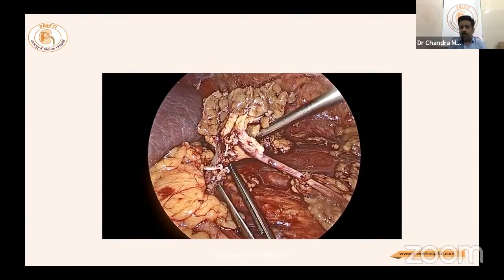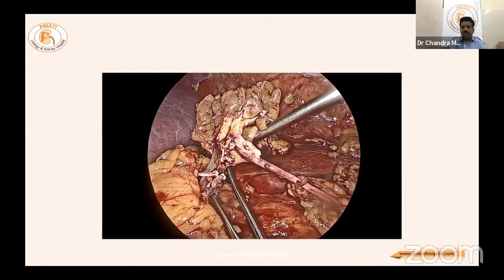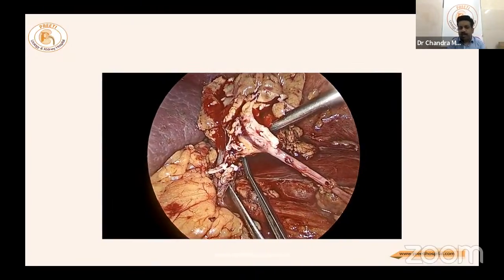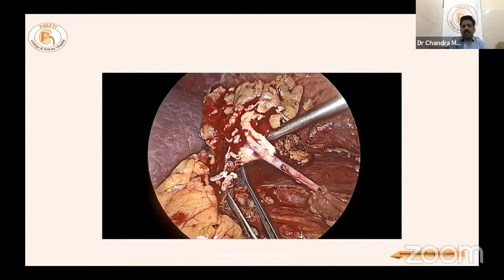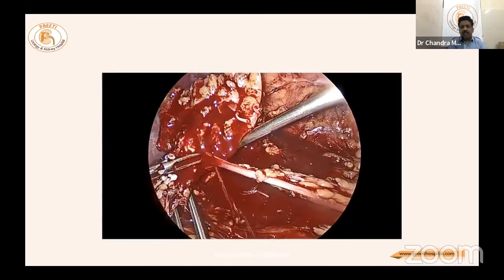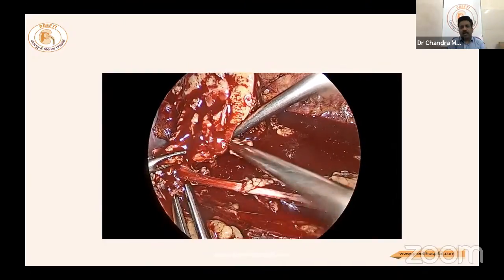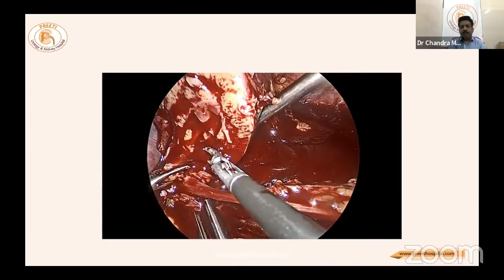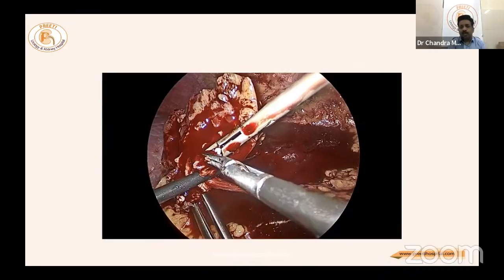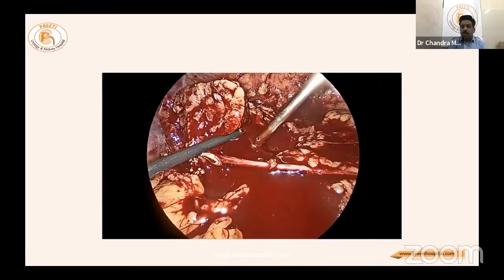The clamp is boldly released, as all lower pole vessels have been divided. After releasing, one major vessel was found — it was not re-clamped because reperfusion can occur. The person lifting the kidney is very important at this stage. A small sputter is identified, caught with the right hand, and the assistant applies a clip — that's all needed.